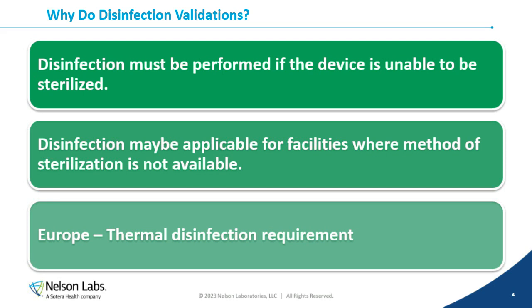Additionally, disinfections may be applicable for facilities where sterilization is not available. So for some of those devices that may be sterilized, but disinfection is the minimum requirement, maybe where you are marketing your device, some of the facilities don't have access to sterilization methods, and so disinfection is a great option for those facilities.